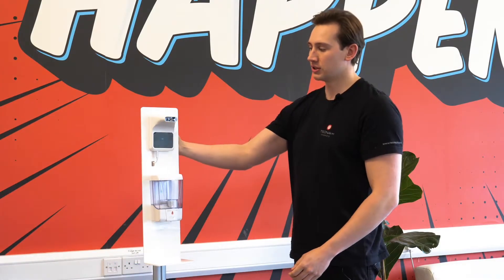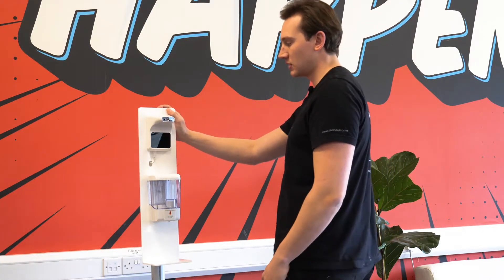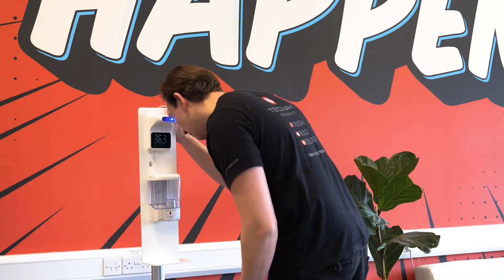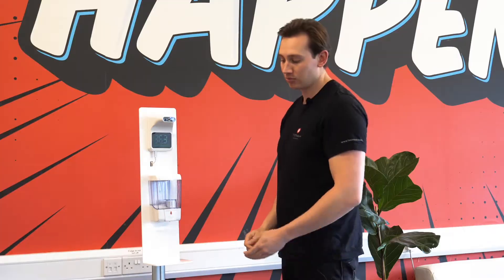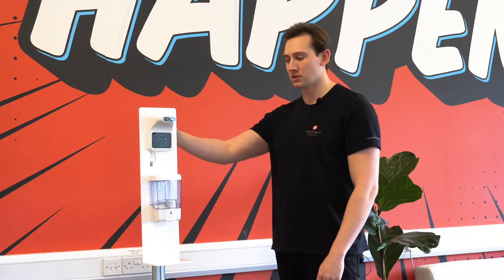If we take a closer look, you'll see the automatic thermometer on top has two sensors. You come within 10 centimeters and it's going to read your temperature and show it on screen. At the same time you can be dispensing sanitizer onto your hands, making it a really efficient solution for staff and customers.